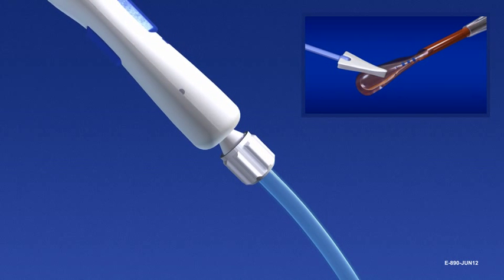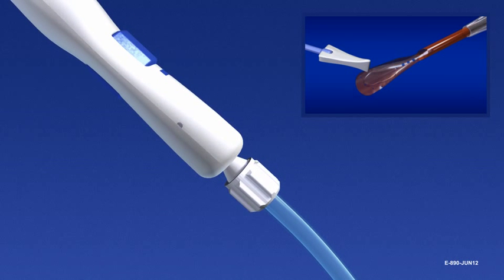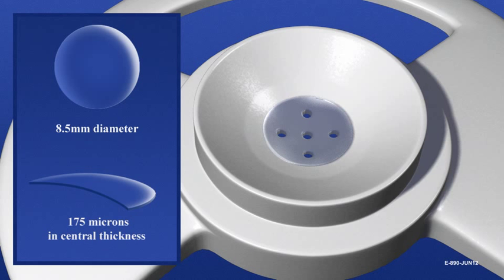Do not shake the EndoSaver. Stop irrigation and do not restart until the tip of the EndoSaver is in the anterior chamber. Allograft tissue is refined by the surgeon to the preferred diameter. The EndoSaver is designed to insert tissue measuring less than or equal to 8.5 millimeters in diameter and 175 microns in central thickness.